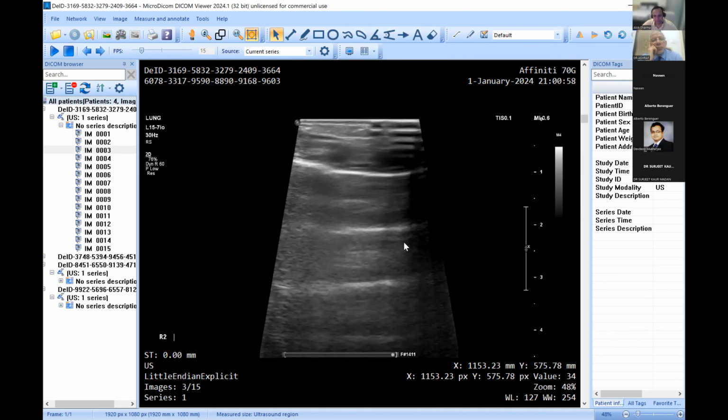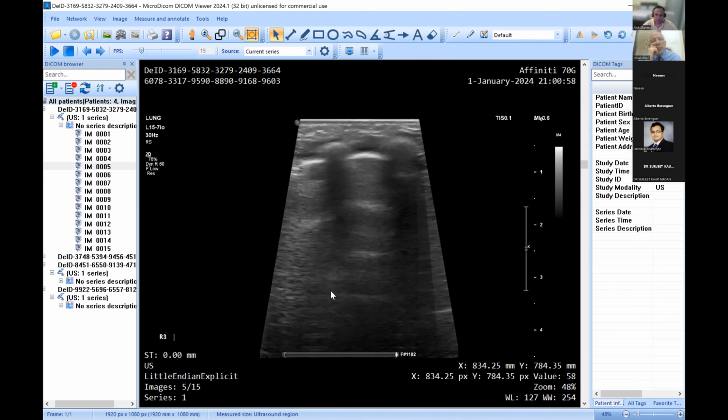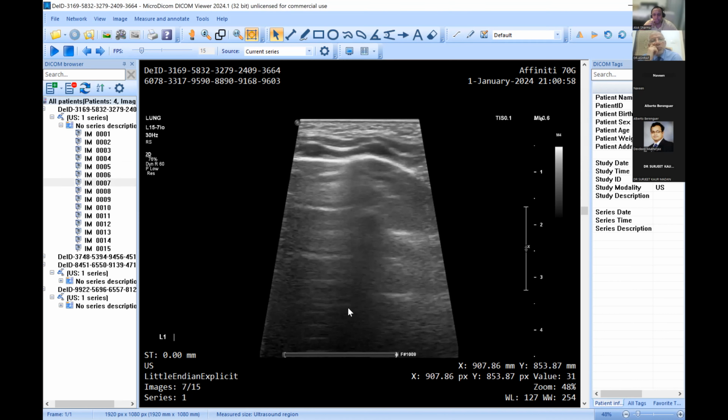And this is R2, just going downwards. Again I think these are 2 ribs, that's a bat sign, and you can clearly see the A lines with literally no B lines. It was very well aerated lungs. It's the same at R3. Of course the loops are missing, but don't worry, the images are very nice. You've got the anatomy in its totality. For me, the fact that you're getting really good, uniform penetration up to 4 centimeters is really, really good.